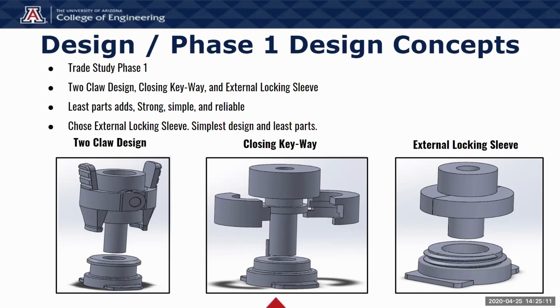There are three designs. On the left, you can see the two claw design. In the middle, you can see the closing keyway design. On the right, you can see the external locking sleeve design. We discussed and experimented to choose the design with the least amount of parts required that would be strong, simple, and reliable. We ultimately chose the external locking sleeve because it was the simpler design and required the fewest parts.